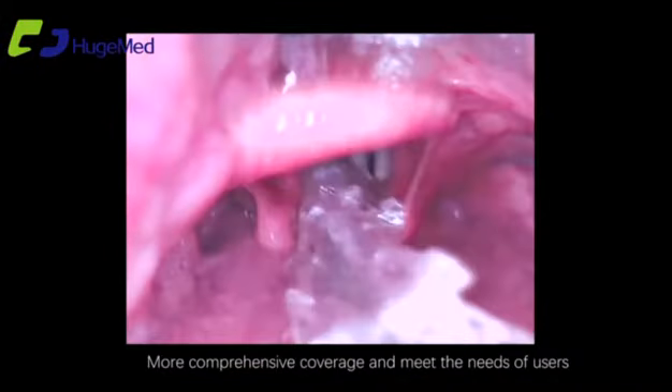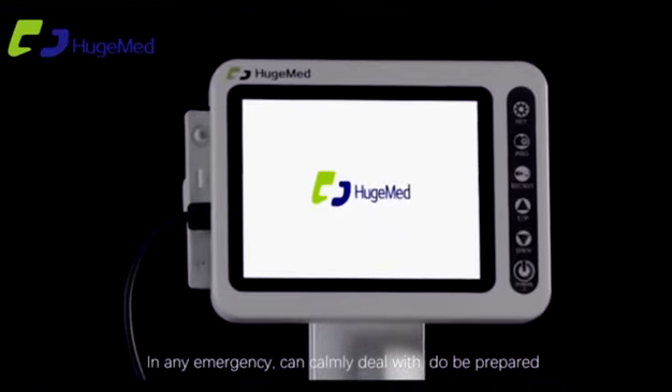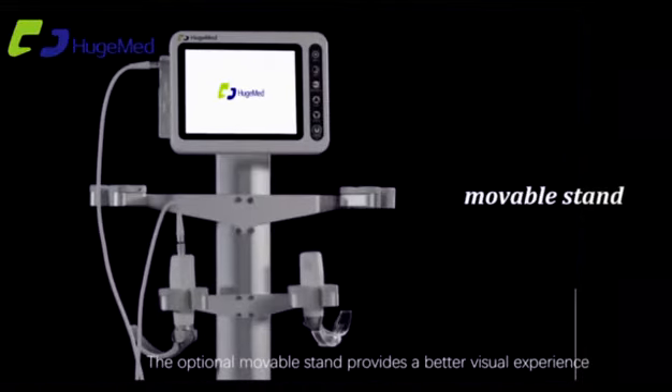These blade options meet the needs of users in any emergency situation. The optional movable stand provides a better visual experience for the operator.